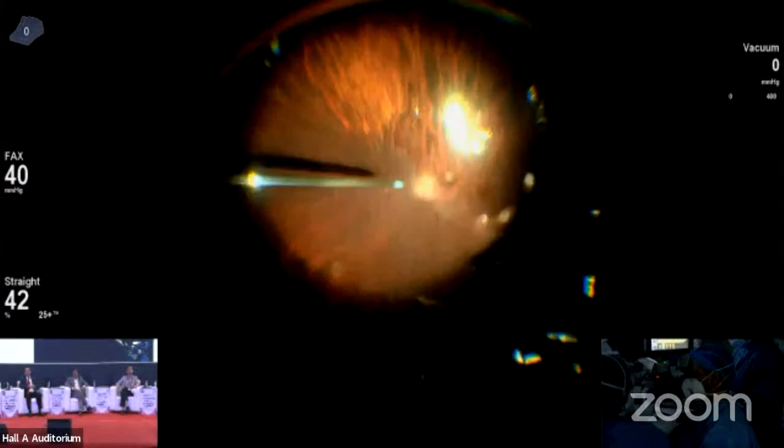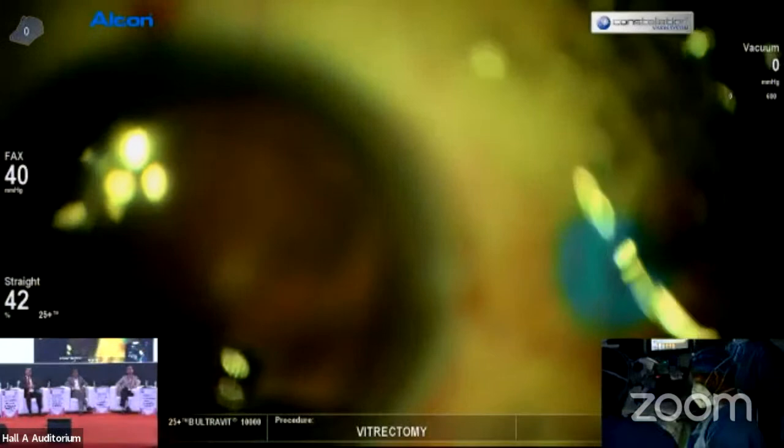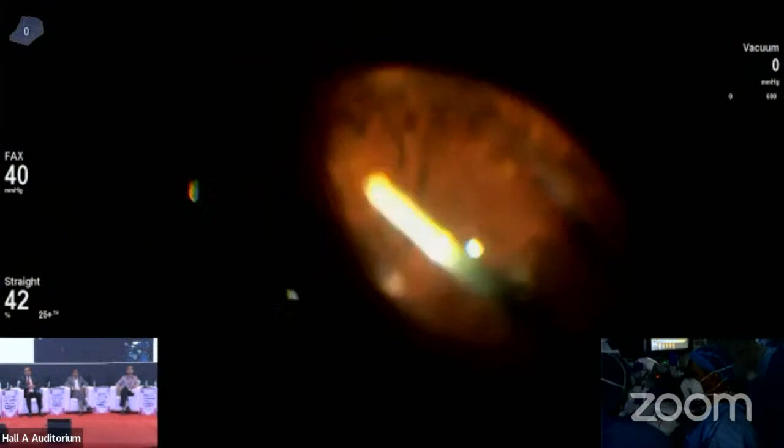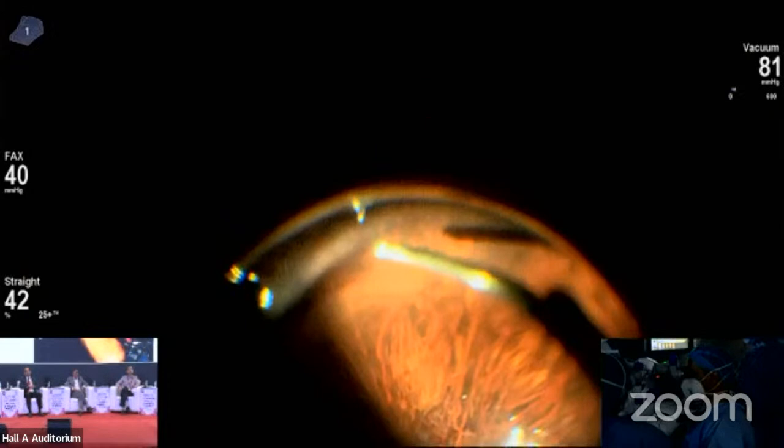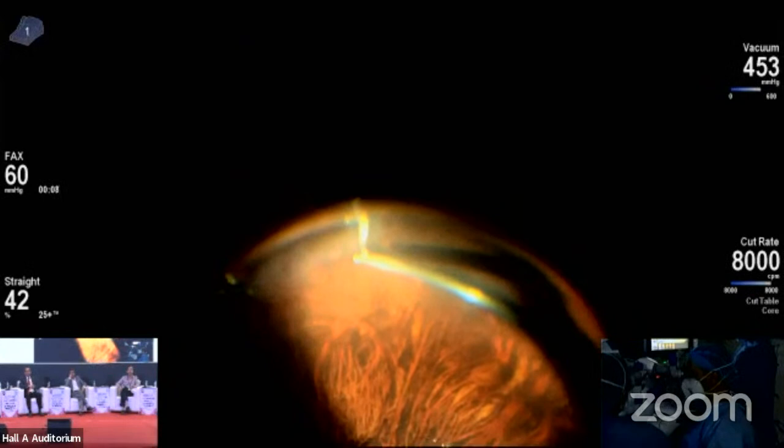So we are just drying over the surface of the disc, and our vitreous cavity is now completely replaced with air. So I'll just go ahead and complete my peripheral vitrectomy. So you can see the skirt of peripheral vitreous which is there. This is interface vitrectomy.